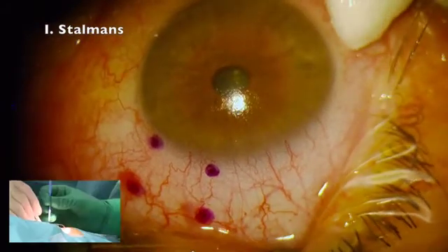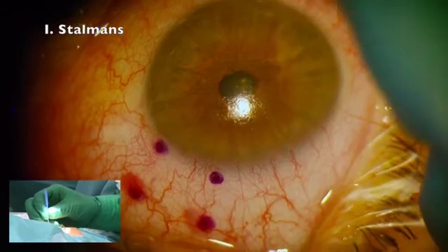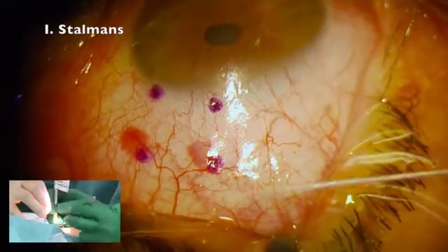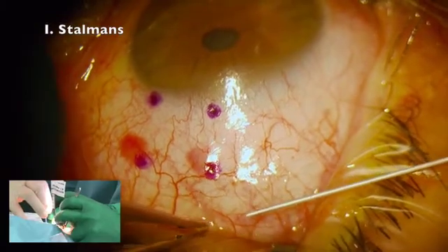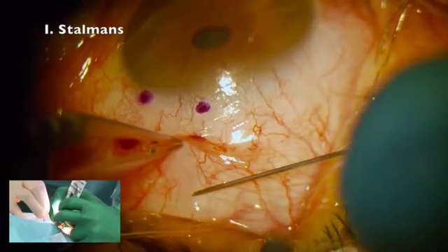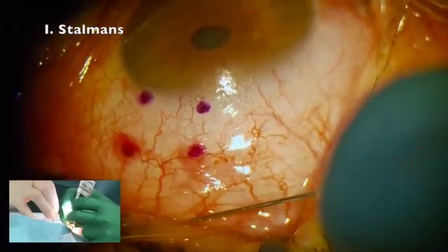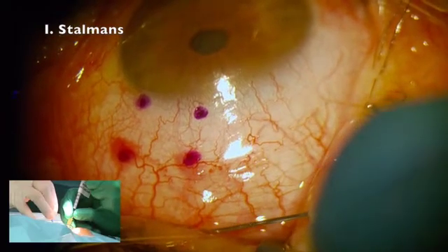This is really — I get the question quite often — what concentration should we use, and that is really dependent on your patients. I advise surgeons to look at the concentration that they use for their trabeculectomies, because if you need higher concentrations in your trabeculectomies, then you may also need higher concentrations for your Xen. I use 0.2 milligrams per ml in my trabeculectomies.